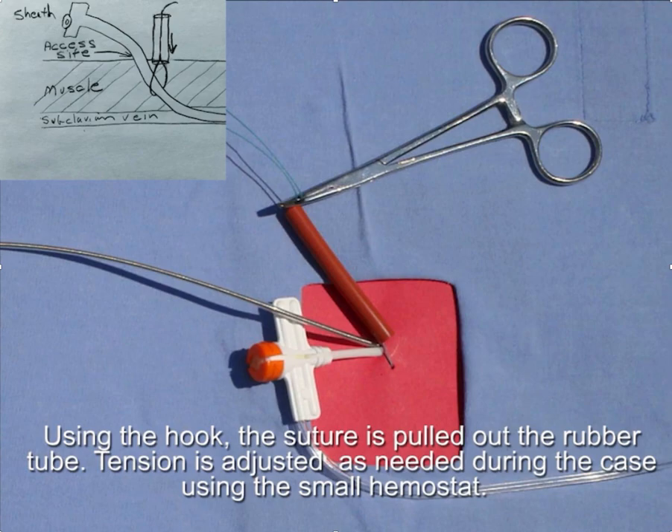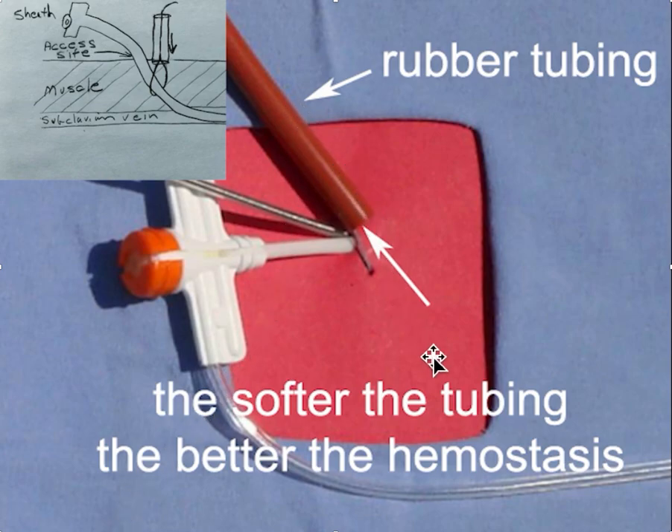The tension is adjusted as needed during the case using the hemostat. If you're having trouble manipulating the leads, you can release some tension. If you're having more trouble with hemostasis, you can add more pressure. The softer the rubber tubing the better, because you want it to fish-mouth out around the superior part of the access site — which makes some homemade versions less effective, such as when using plastic tubing that comes with a large needle.